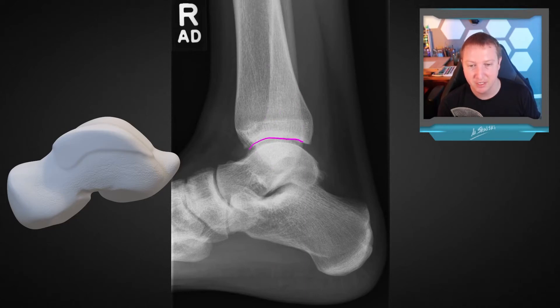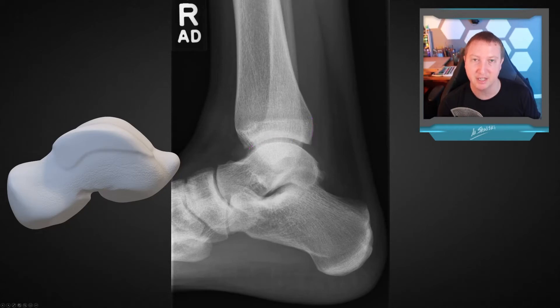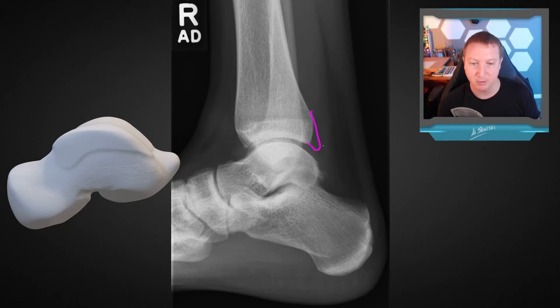This is our tibial plafond, and we call the region back here our posterior malleolus, which can be variably sized. In some people it can extend quite a bit and cause posterior impingement.